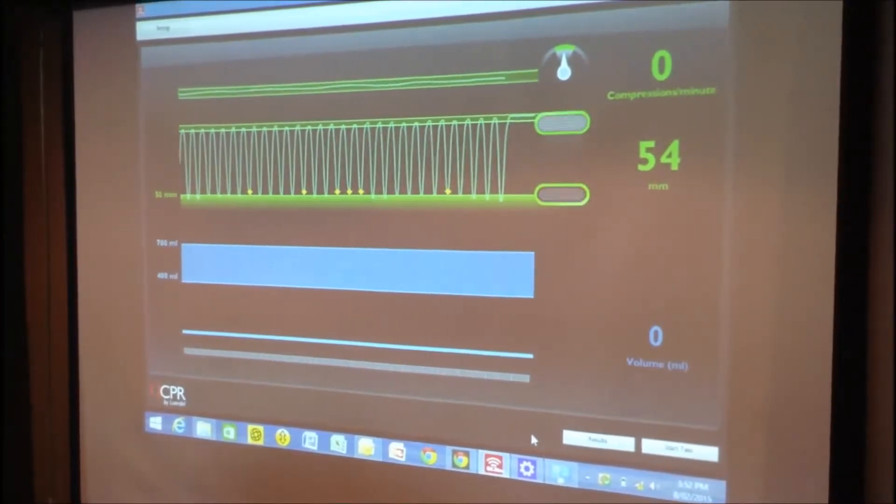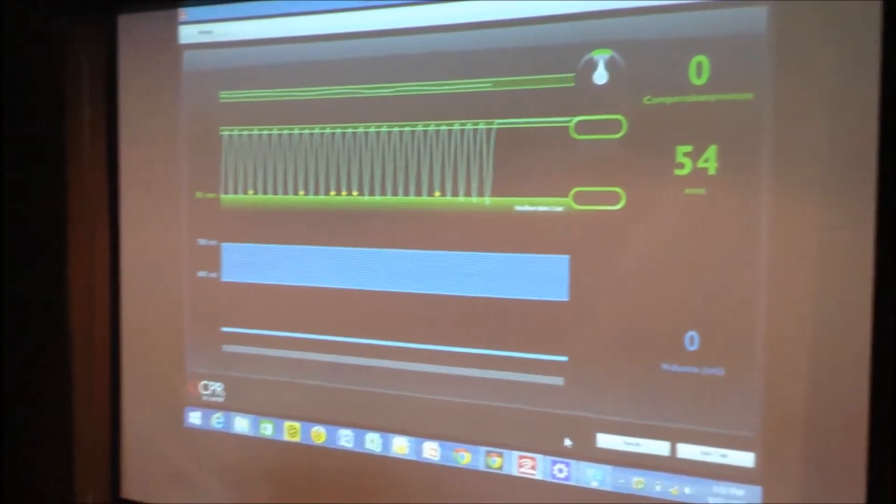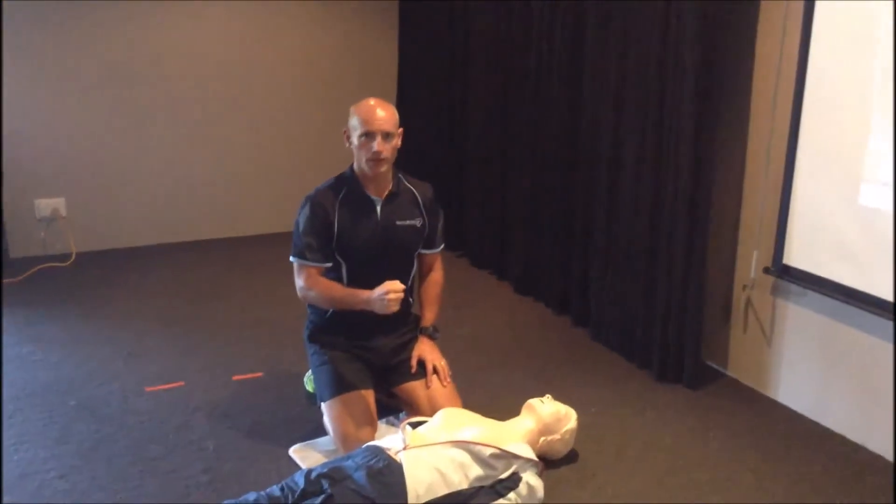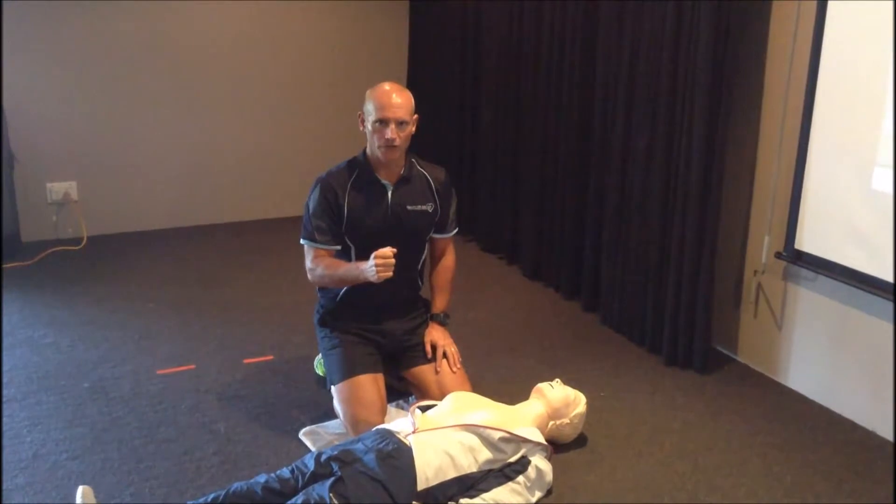So now I'm going to practice some ventilations for you. The first ventilation will be adequate, the next one will be over, and the final one — the third one — will be slightly under where it needs to be.